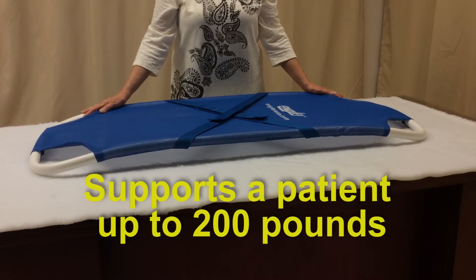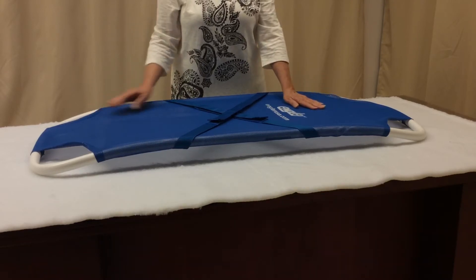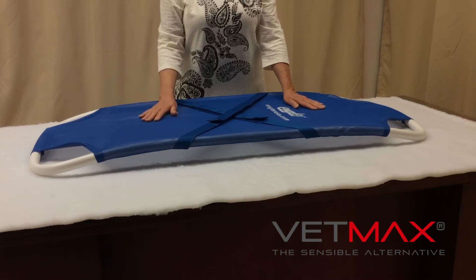You may be interested in watching our video on the stretcher cart combination and the stretcher gurney combination as well, if you are thinking about this.